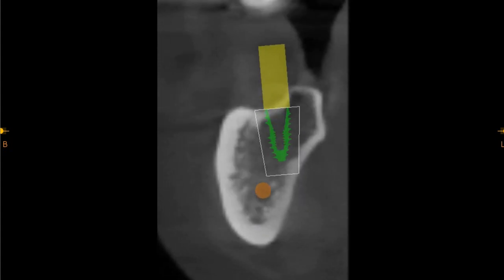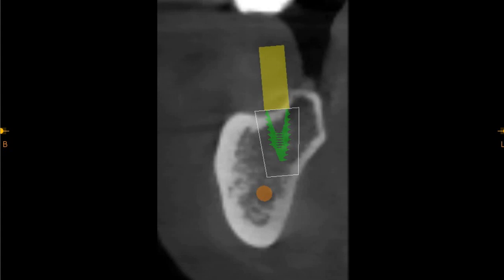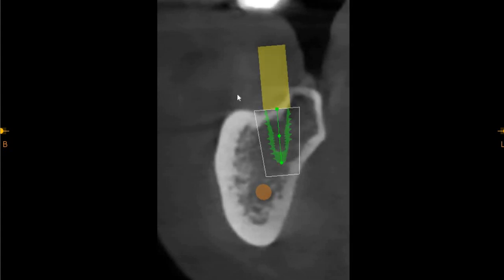And this is the second molar implant. This implant has to be placed very carefully because the ridge configuration and anatomy is slightly confusing, as well as the fact that there is a lingual fossa present here. So the implant, even if it is placed in this region, can be prosthetically restored and will have absolutely no problems in implant placement in terms of bone support.